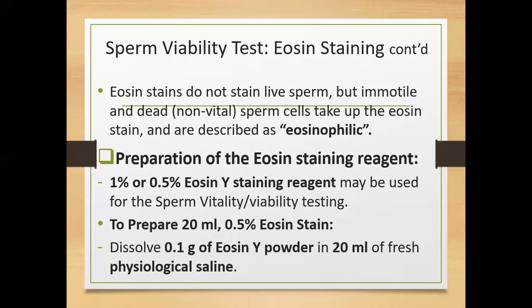The medium in which it should lie. Yeah, it should be in saline, physiological saline. Otherwise, because we are talking about viability, those that are actually not dead, if you put them in a medium that has water in it, of course every cell, once it is exposed to water, will take in water by the action of osmosis. That's very, very simple. We want to avoid that.